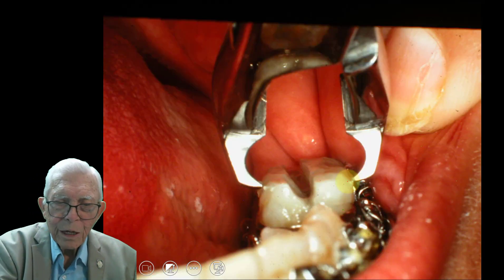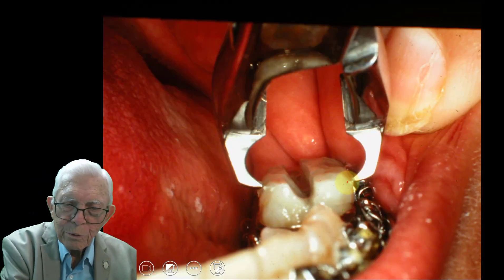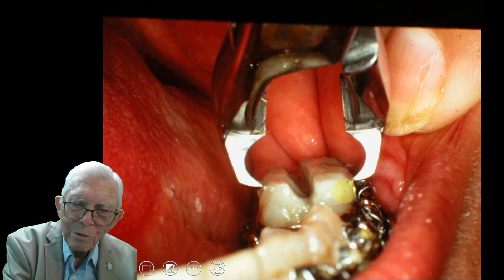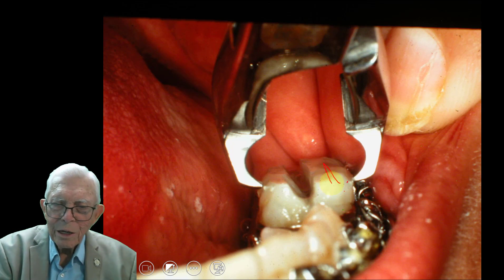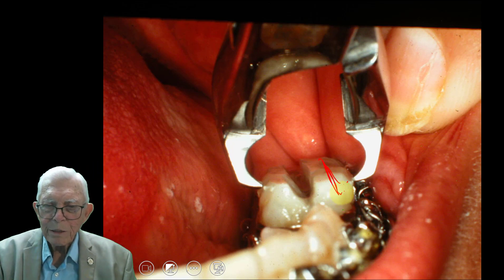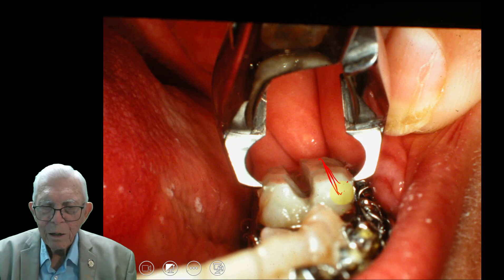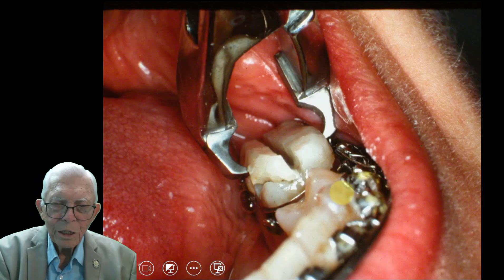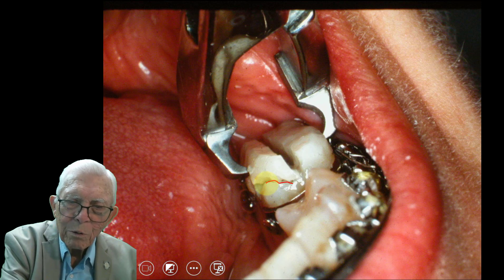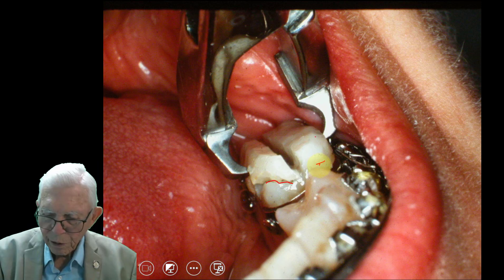You dig in here and press down, and you see one side will start to give. You kind of lean your plier and weaken the other side. If you have trouble with it, you can grind this side down too. You can just piece that together and that will pull that bond loose from the teeth. You see this side is coming up, and we kind of lean and pull on that one, then weaken the one over here.